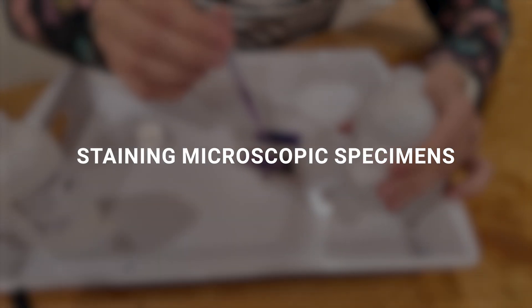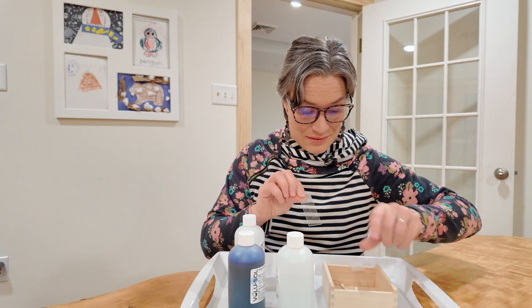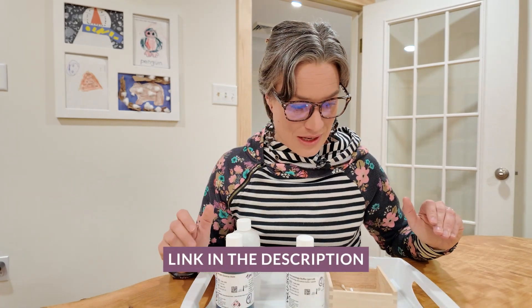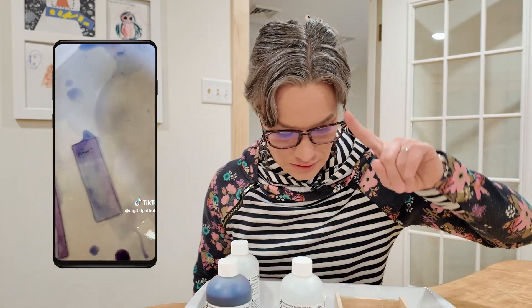Now we need to stain it and check what's there. I was expecting a suppurative discharge — I was expecting this to be pus — but then I did some reading and it can just be mucus, so we're going to see what's in there. I have this Wright-Giemsa stain that I bought on Amazon; it has everything to stain cytology samples. I recently even diagnosed my sister with strep throat at home with this kit.